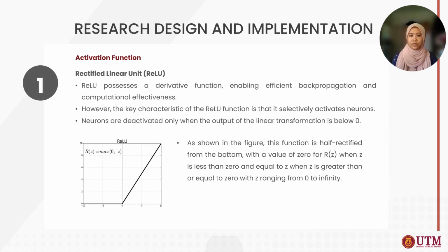The first activation function that will be used is the rectified linear unit, which is ReLU. ReLU possesses a derivative function, enabling efficient backpropagation and computational effectiveness. However, the key characteristic of the ReLU function is that it selectively activates neurons.